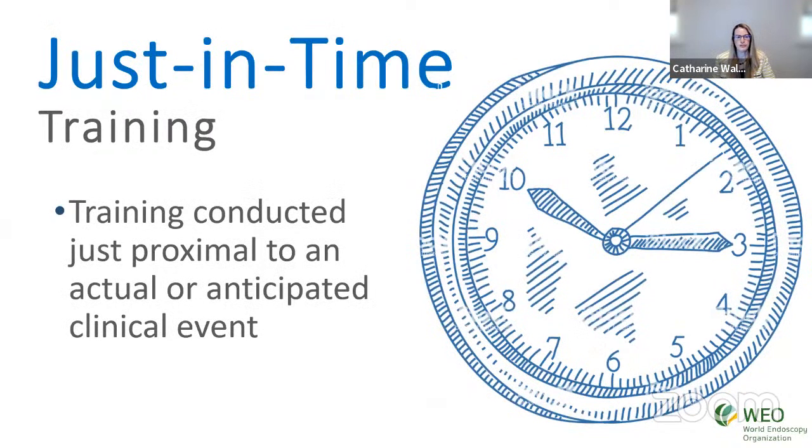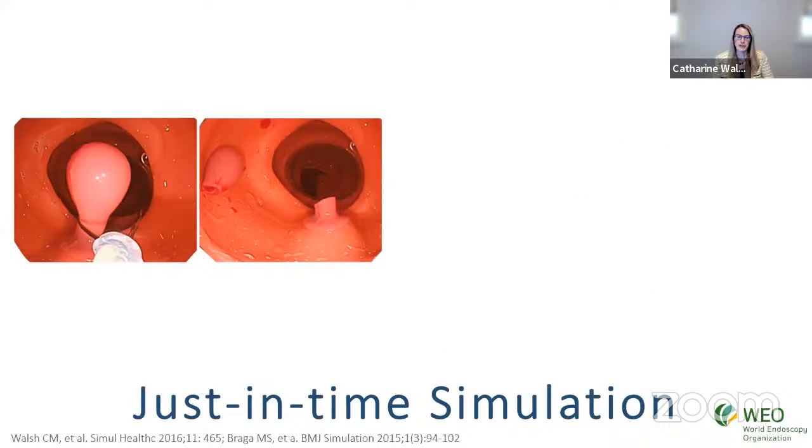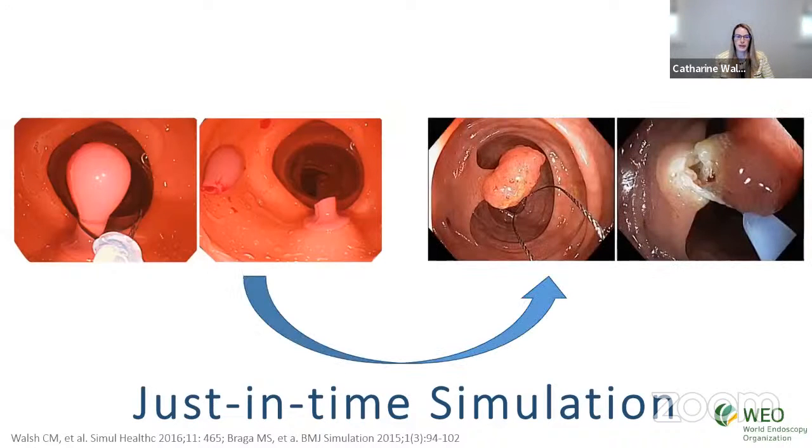A second strategy is just-in-time training. So this is training that's conducted just before an actual clinical scenario. This is akin to the idea of rehearsing in sports or in music, so that you practice the piano before you go out and do a performance. So I know at our center, we're implementing this with regard to polypectomy. So ahead of people doing a procedure where they have a potential polypectomy, especially for the more novice trainees, we'll have them practice this on the simulator so that when they go out and do the procedure in real life, they've had that practice or that warm up.